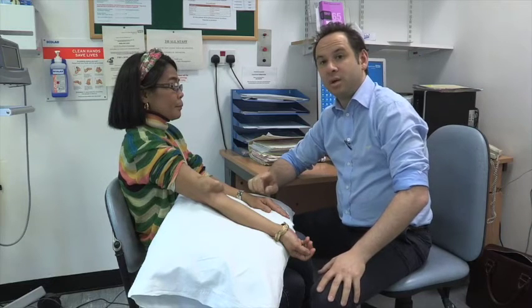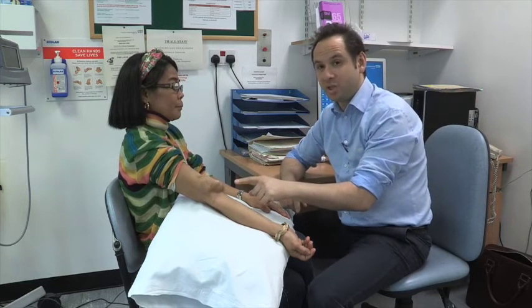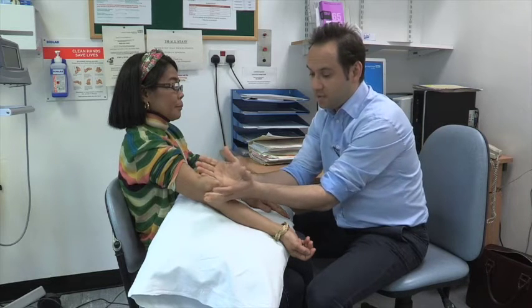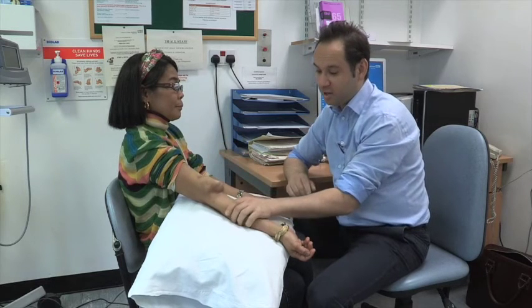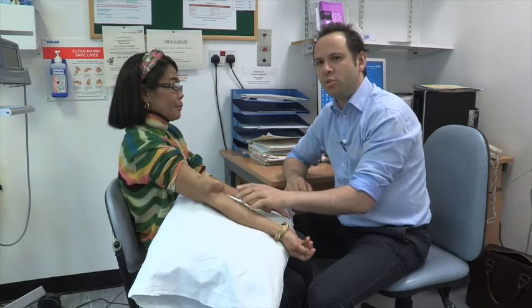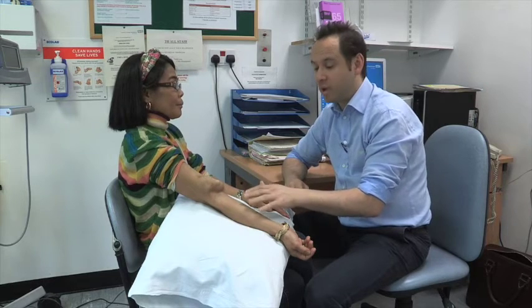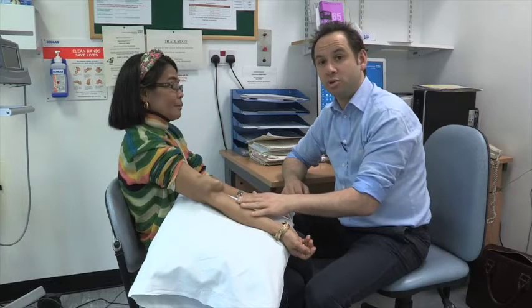Sometimes fistulas can become large with time. Samira here has what we call an aneurysmal fistula, and you can see this is very, very large — and she's only got a tiny arm. This is one end of a spectrum; this is not the normal situation. However, the important thing is that no renal patient should have an aneurysm on their arm of this size. It's unsightly and it's not nice, so I'm going to remove it for her.